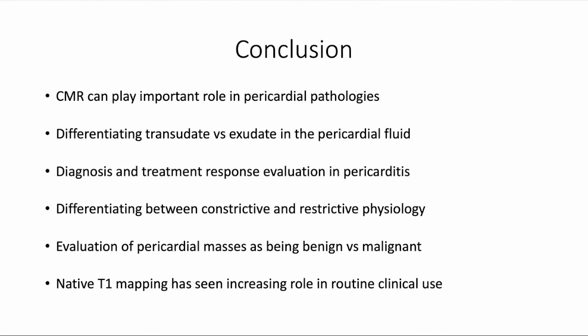We can also evaluate various pericardial masses and classify them as being benign versus malignant so that the appropriate treatment choice can be taken. And with the advent of native T1 mapping sequences, there are many more opportunities to be explored on how these mapping sequences can be helpful to evaluate pericardial pathologies.